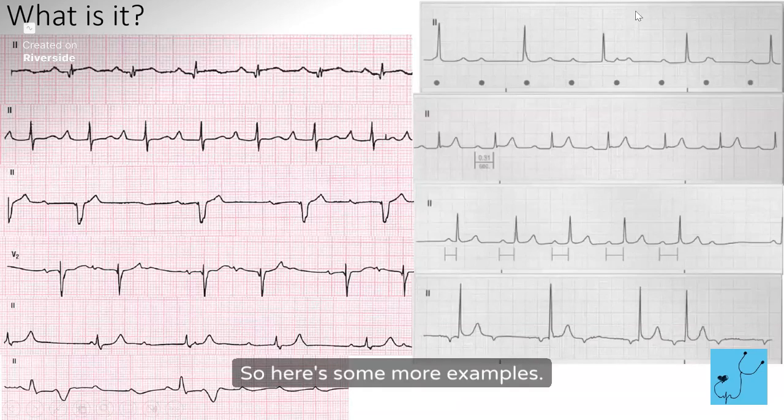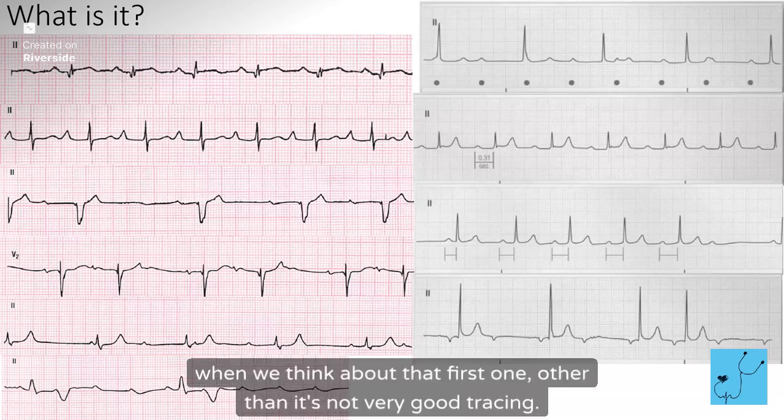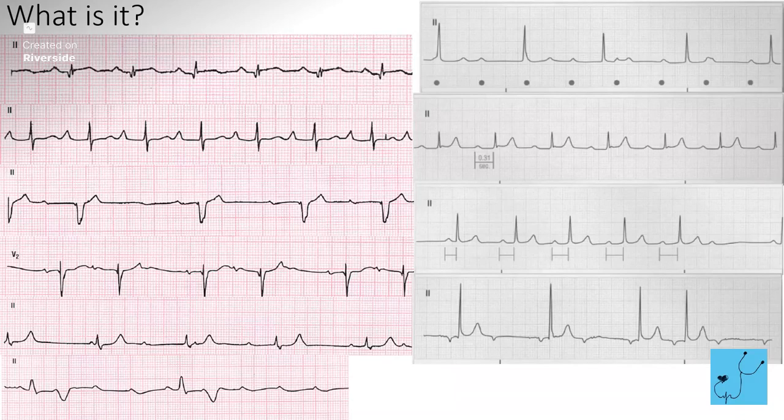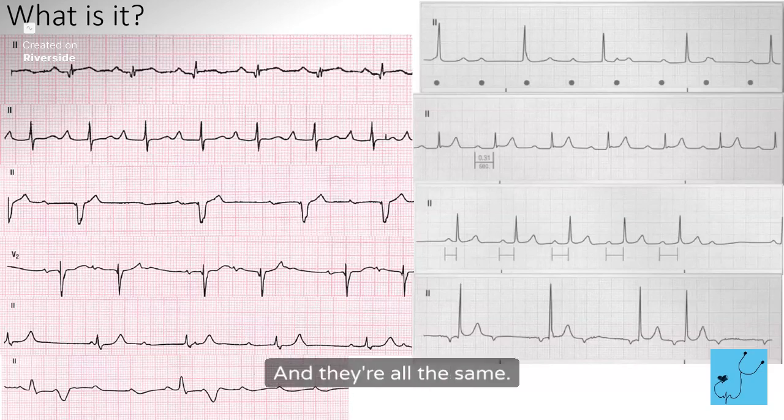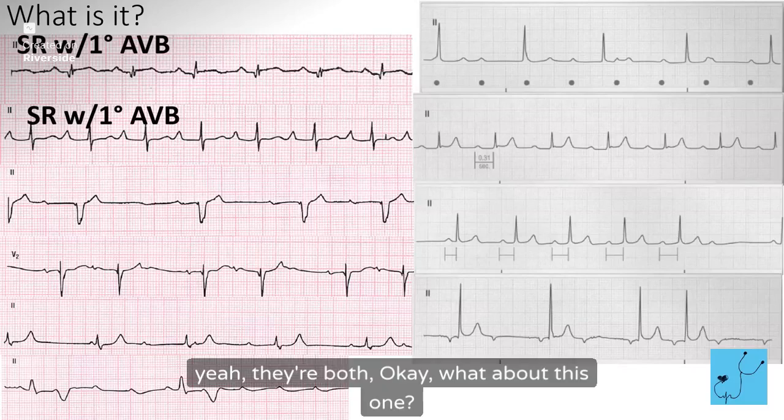All right, so here's some more examples. What do we think about that first one, other than it's not a very good tracing? Yeah, the PR is prolonged. And they're all the same. They all appear to be the same. And every QRS has a P. The second one, yeah. It's easier to see because it's a better tracing. Oh yeah, they're both, yeah. Okay, what about this one?